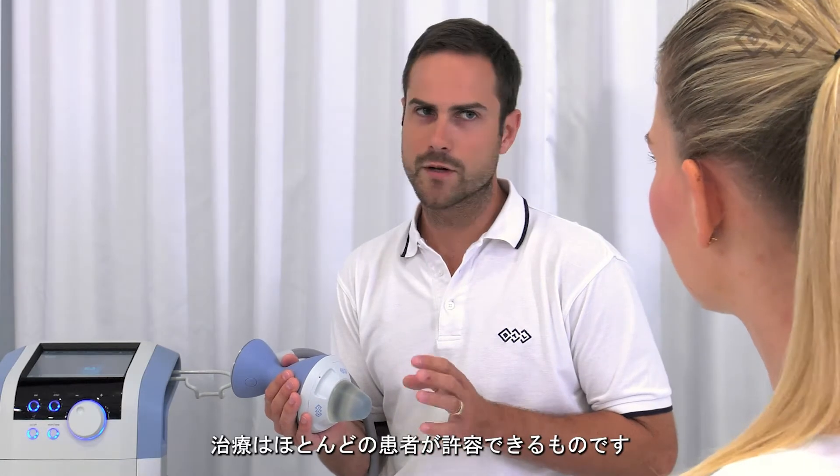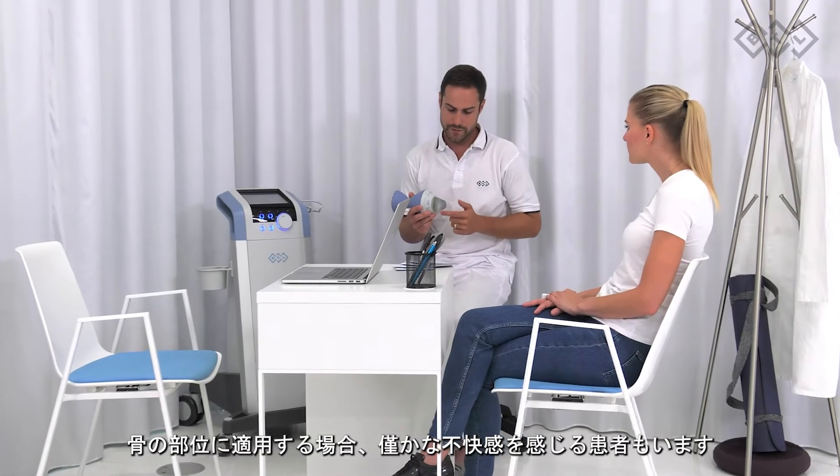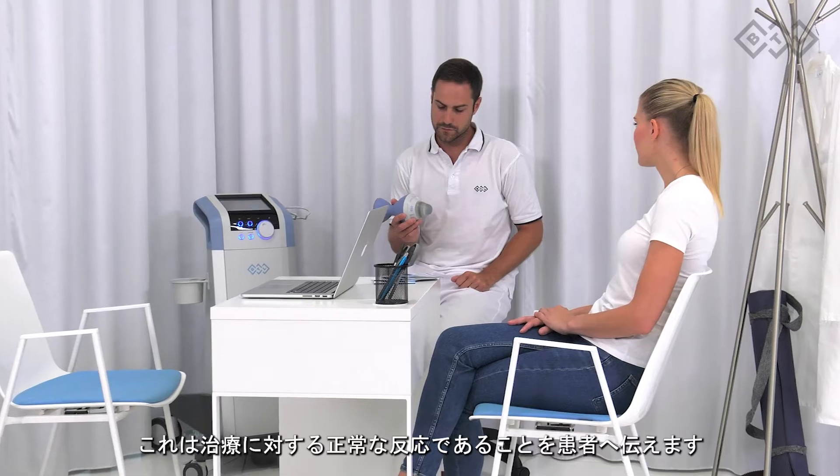Therapy is well tolerated by the vast majority of patients. Some patients might feel a slight discomfort if applied in the bony area. Assure the patient that this is a normal reaction to the therapy.